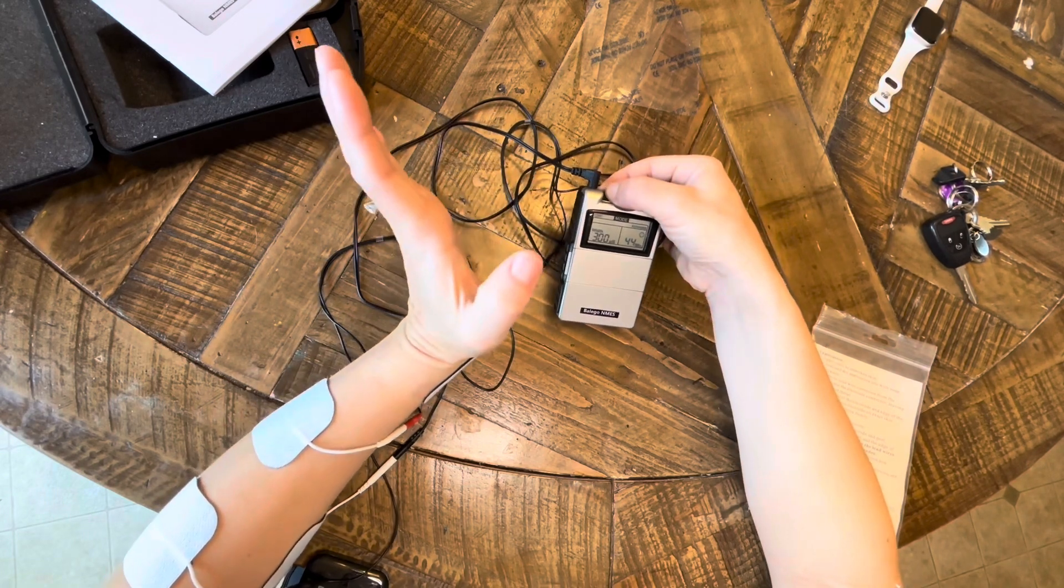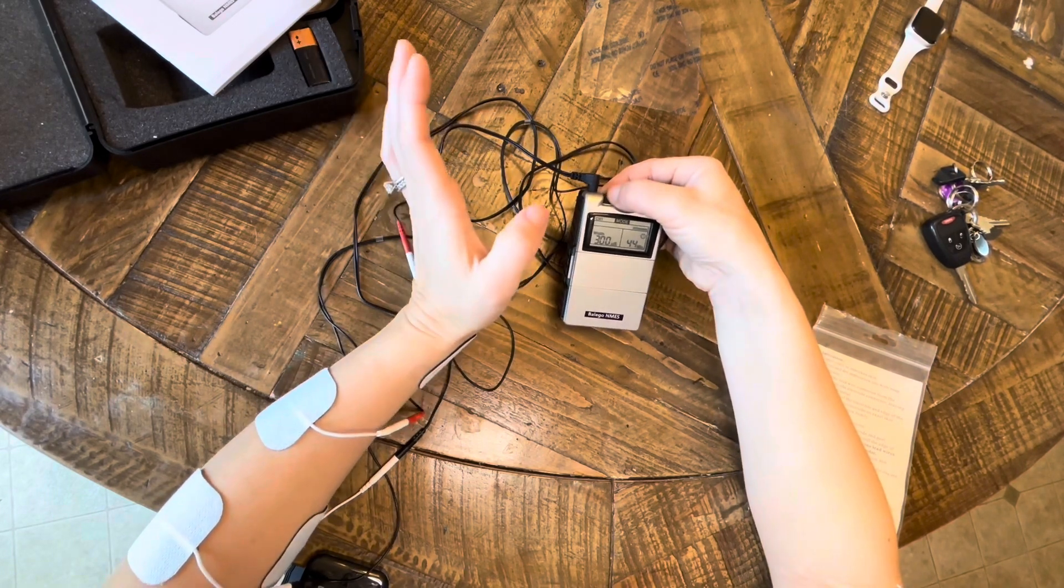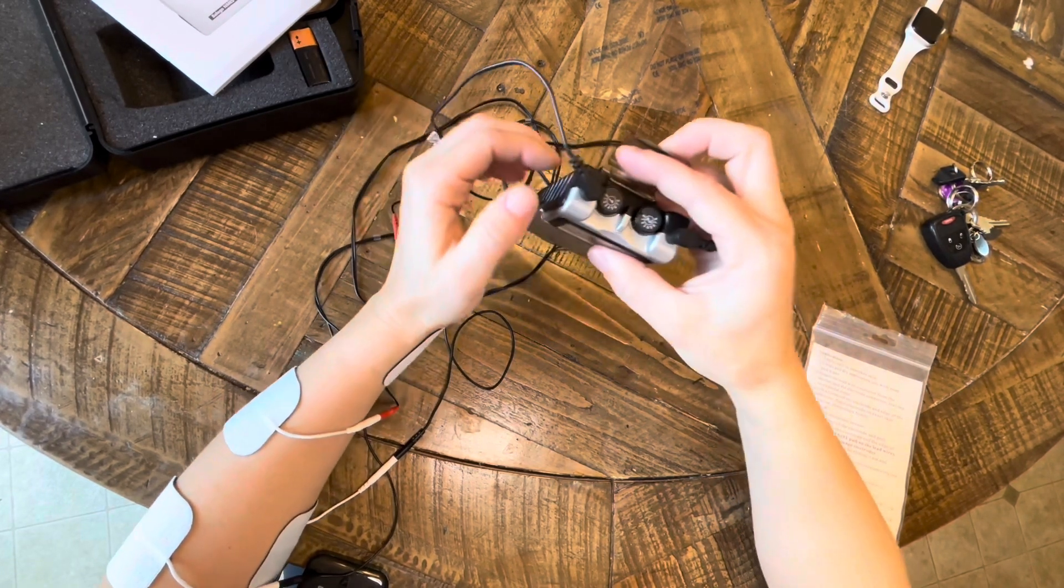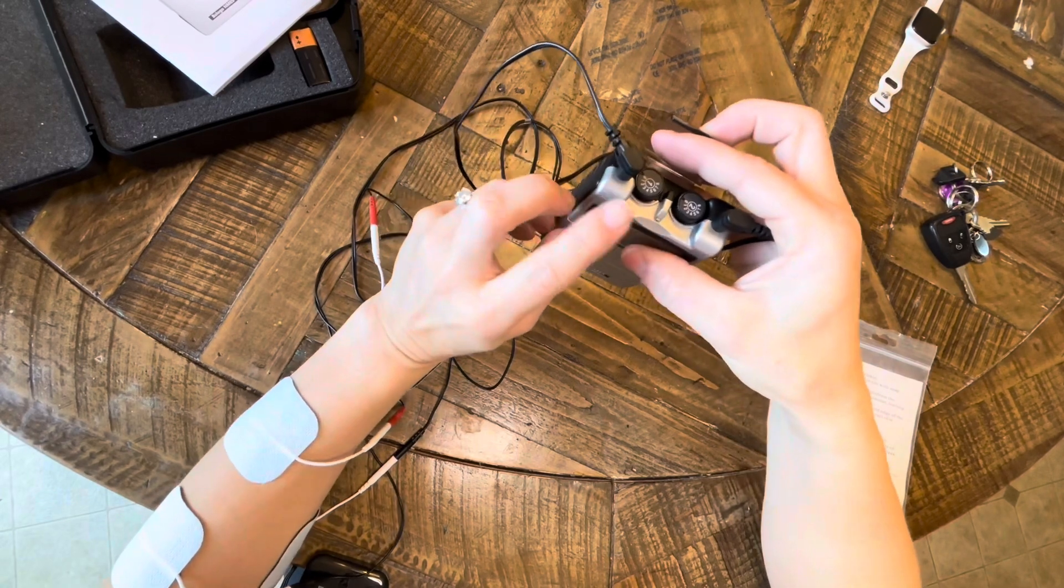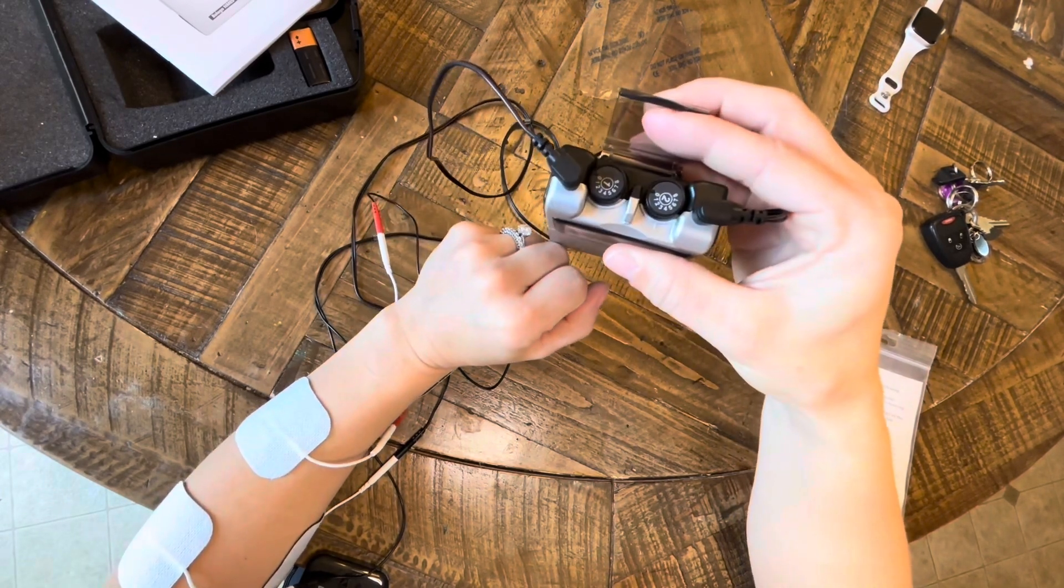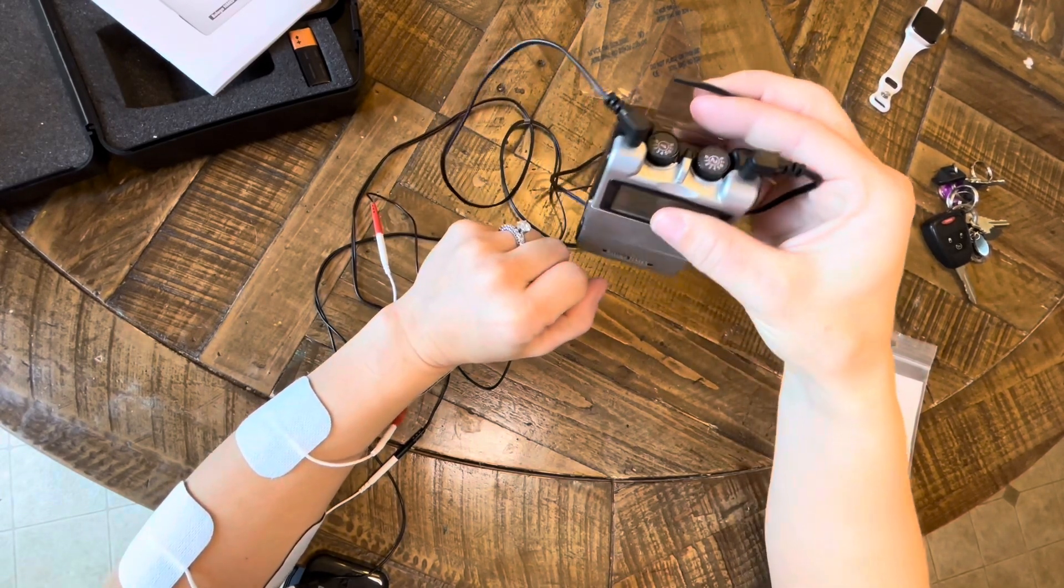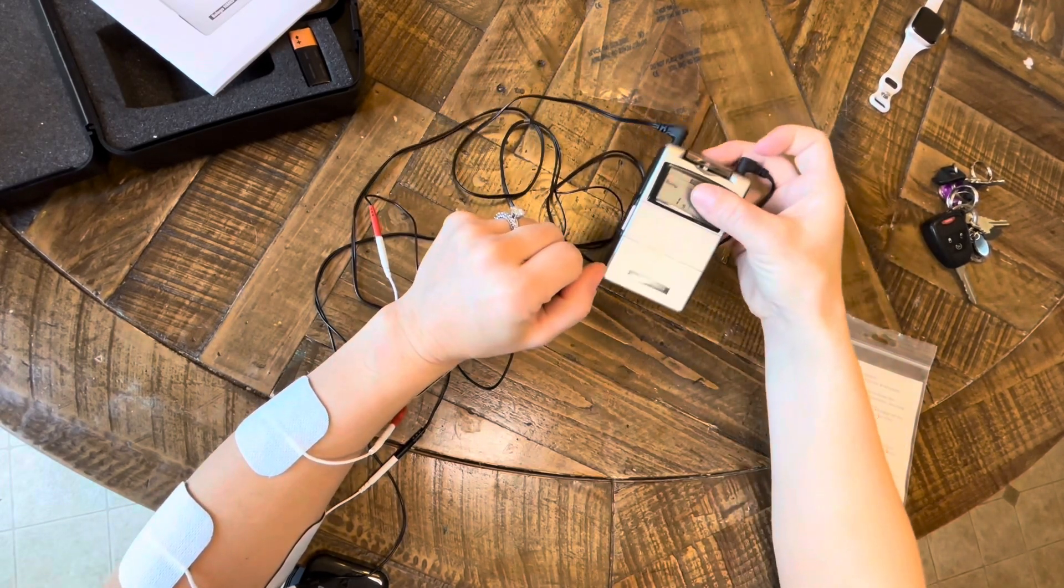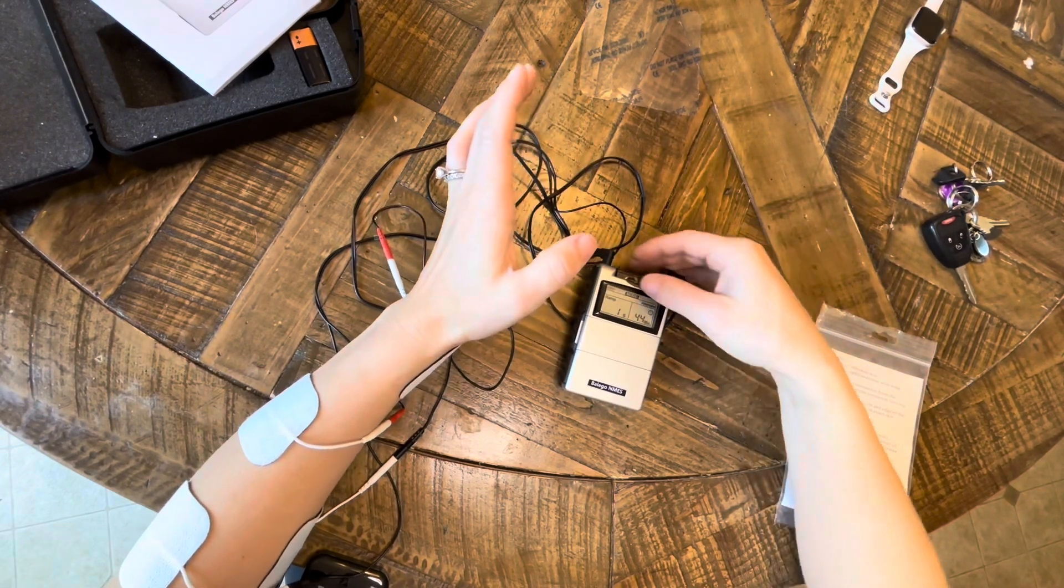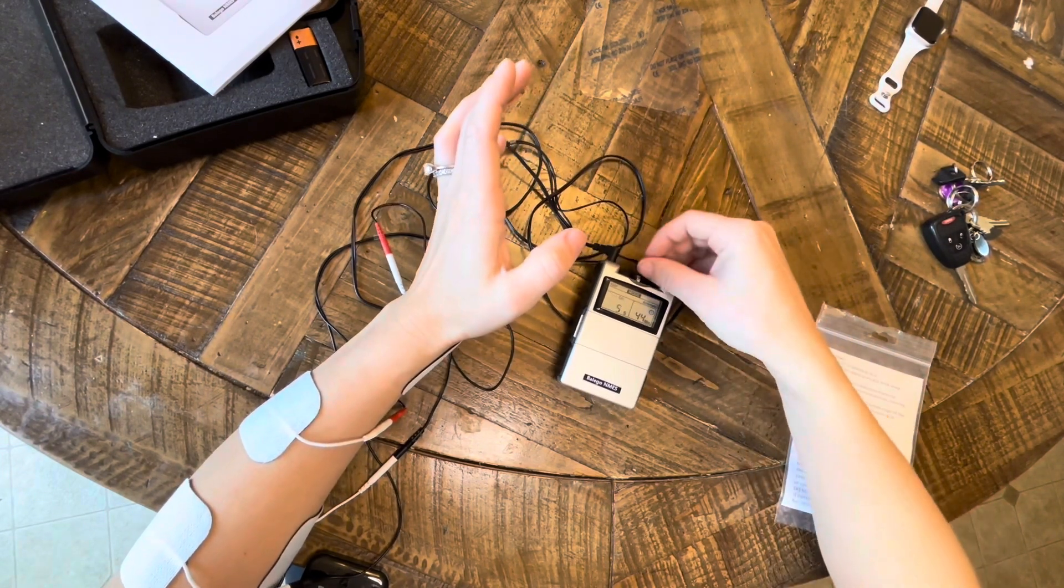Personally on me, I get a good response between like three, four, four and a half, depending on how new my electrodes are.